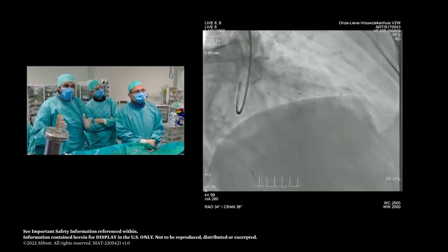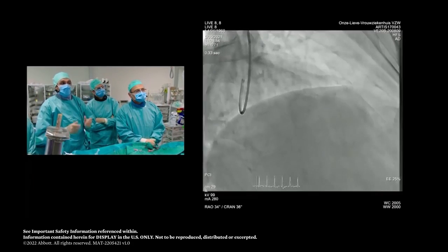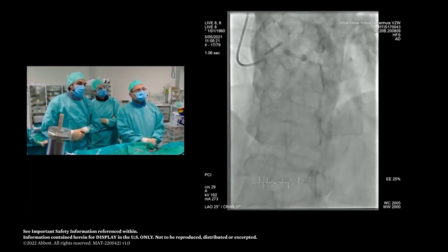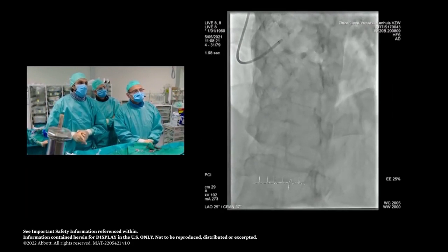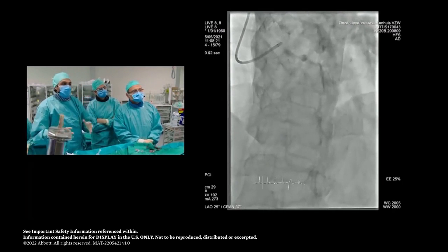So we're talking about a long calcified disease in the proximal and mid LAD. We're seeing already there is some calcium in angiography, but we're going to further refine that analysis, of course. And here we see an LAO cranial with more or less the same information. There are 3 diagonal branches. These diagonal branches are small. We have quantified the myocardial mass with CT, and these are small territories.